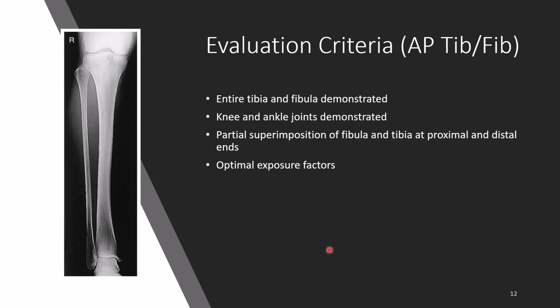The patient was lying on their back for that, and like we said, on a follow-up exam, it may be necessary that you only get the joint closest to the site of injury. You don't have to necessarily include both joints, but it totally depends on what you're imaging for and who the physician is. A lot of orthopedic docs don't require both joints. Some only require the joint closest to the site of injury.